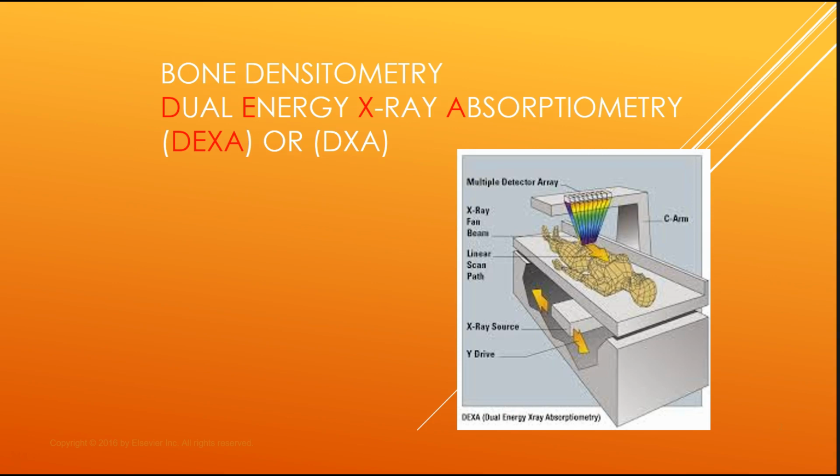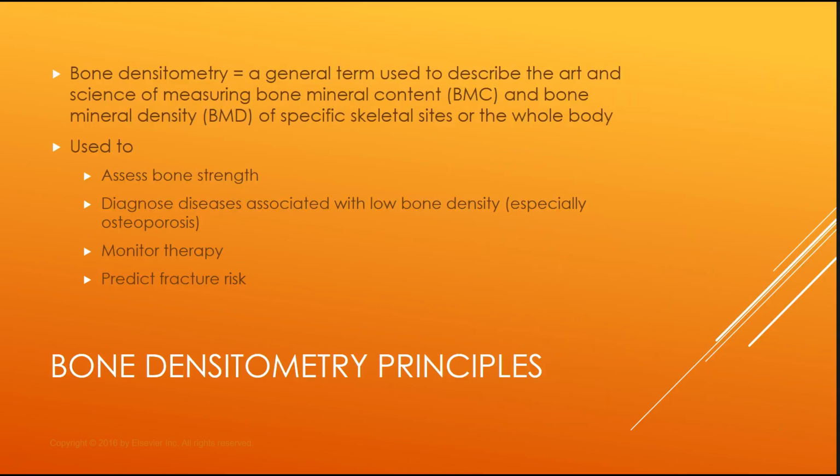Bone densitometry is the measure of density in bone, and DEXA stands for dual energy X-ray absorptiometry. Try to say that 3 times fast. Absorptiometry. Okay, that's what DEXA stands for. It can be abbreviated DEXA with the E or without the E. Both are the same.